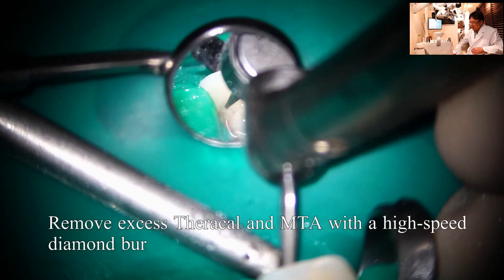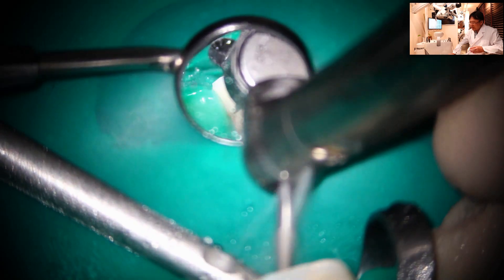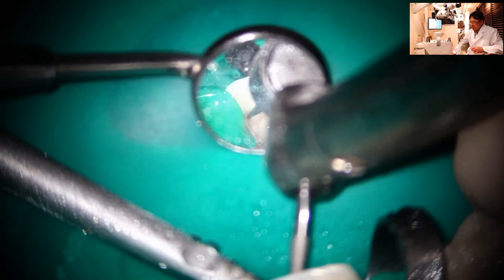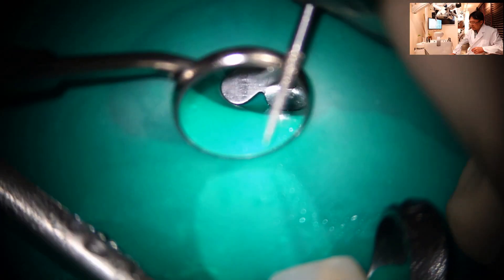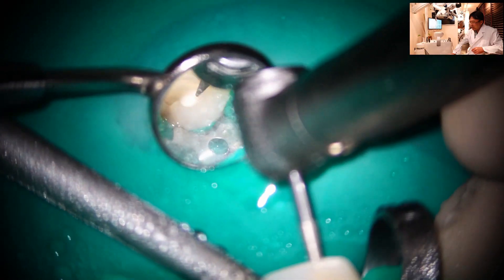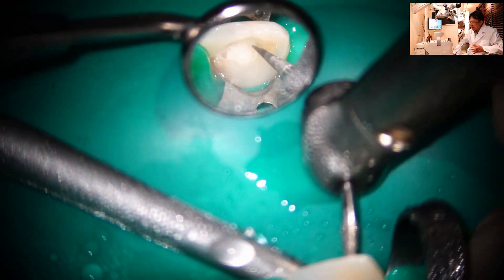Then I'm preparing the cavity for composite. I'm using a high speed diamond bur.